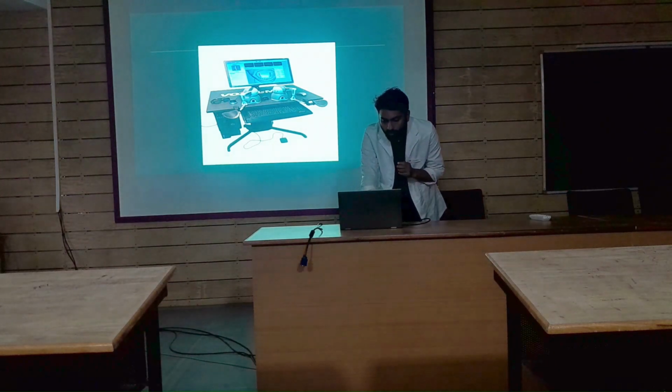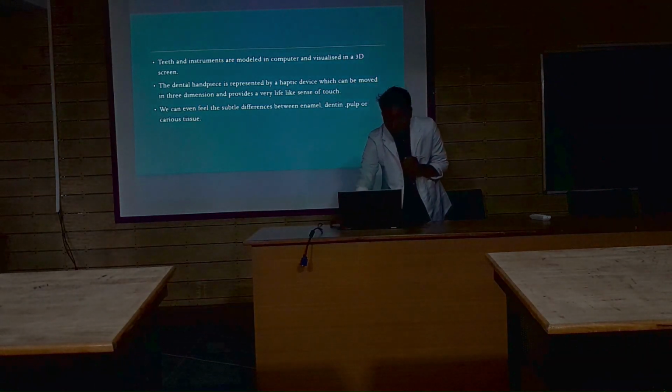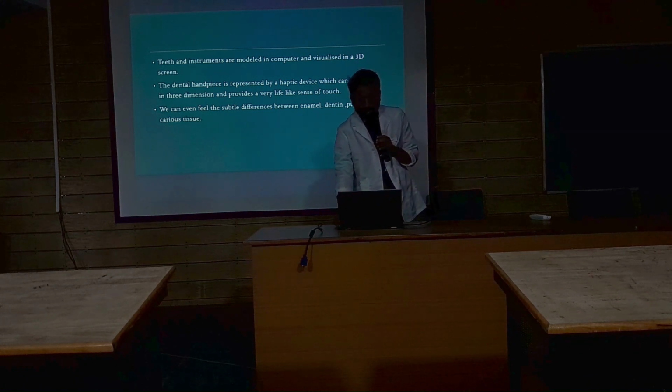So this is the haptic device. It represents the dental handpiece. We can have both the instruments and everything on the screen. Then the importance is that we can feel the subtle difference between enamel, dentin, pulp or caries tissue based on virtual reality.